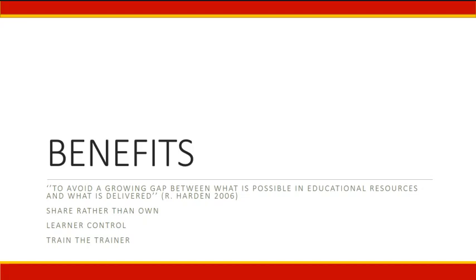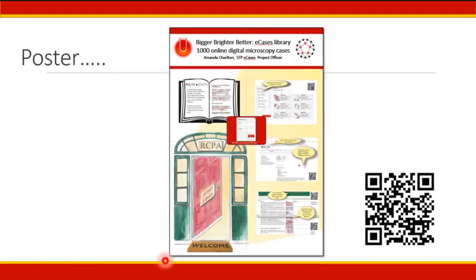Other concepts embodied by online cases is the sharing of resources rather than owning them, which is really back to the concept of a lending library of virtual or online books. The third point is giving the learner control to create a personalized, student-driven learning experience. And the fourth point is training the teachers to use online resources, which I hope I have demonstrated by showing you how to make a virtual slide workshop.